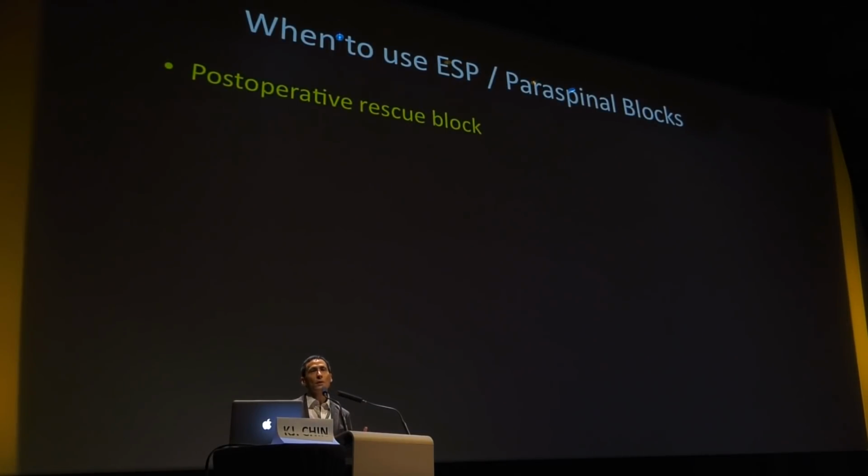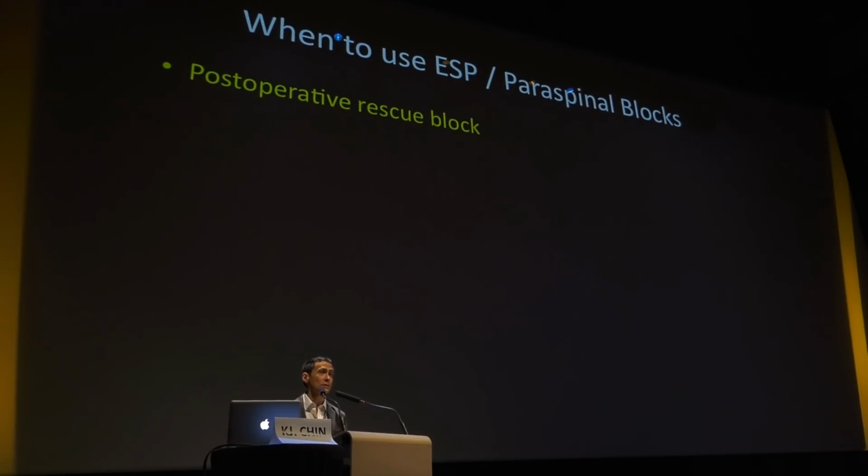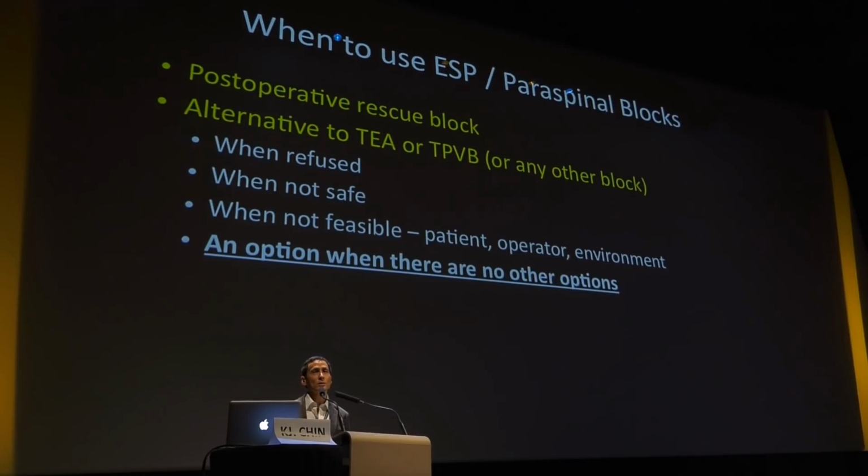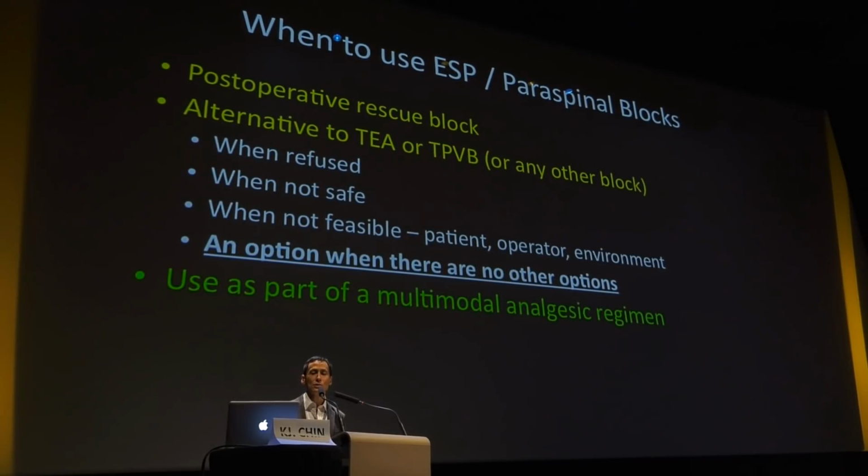So what I would suggest, if you're going to try these blocks, the easiest one is always to use them as a post-operative rescue. If somebody has pain and you have nothing else to offer, try the block. And usually you will see that the pain will come down and go to mild levels, if not to zero levels. And any time that you think you want to do an epidural or paravertebral, but you cannot do it for any other reason, this is a great block to use because really you have got nothing to lose.